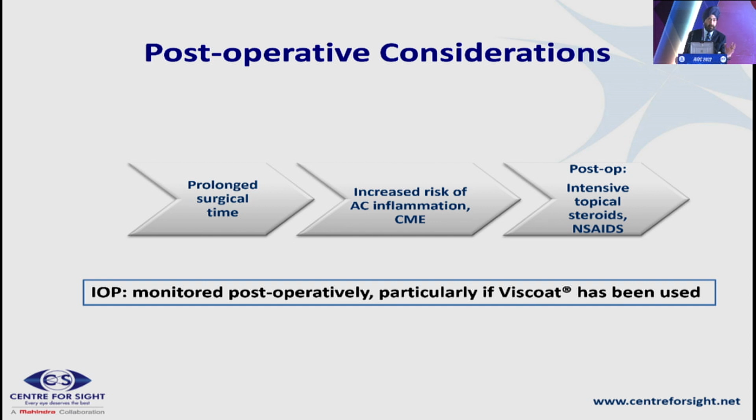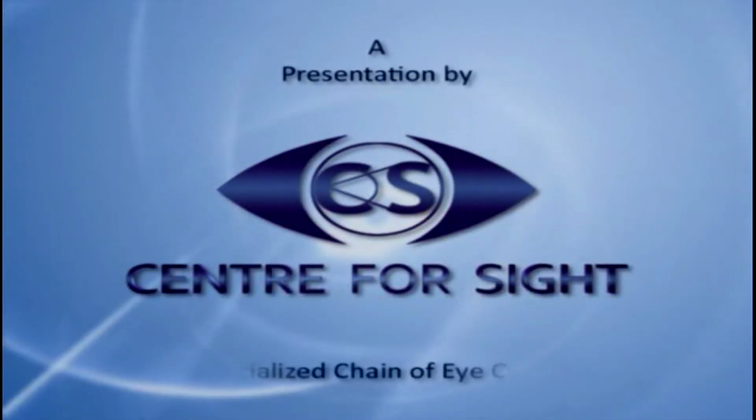So friends, hard cataract is a difficult nut to crack, but if you follow the proper techniques and you take the help of good machines, good technology, which could be good machines, or if you could have a femto laser, I think dealing with a hard cataract is something that can be done easily with phacoemulsification. Thank you very much for your kind attention.